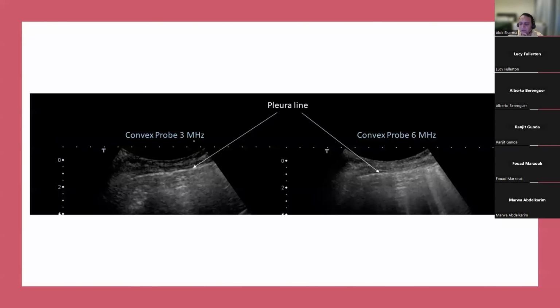So this is the image that I'd like to show you. So can you see at this particular point, Dr. Marwa, that you have tissue for sound waves to interact with? But this is about 4 centimeters. And really what I want to do is I want to see the pleura moving. So this is my area. Now, old machines would allow you to change your focus up and down along this axis to 2 centimeters, which means the incidence of sound waves would be most reflective at this zone and give you a very clear image.